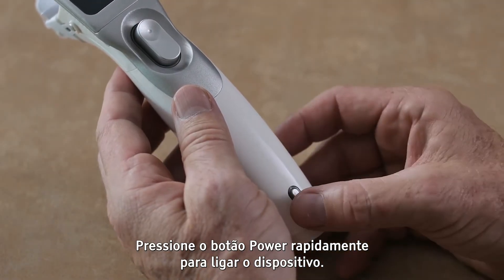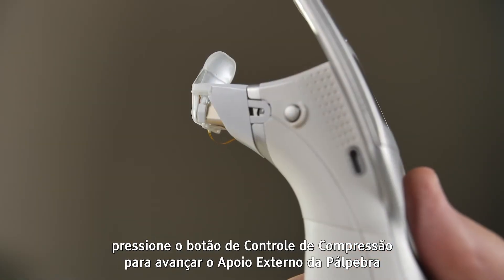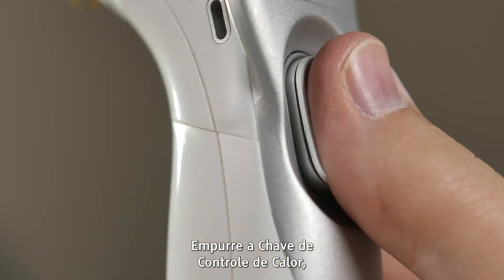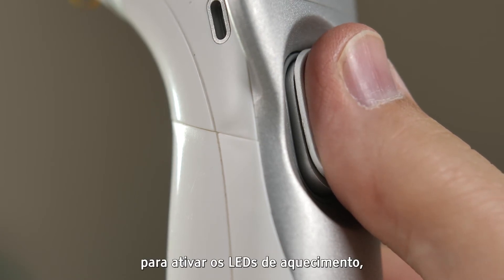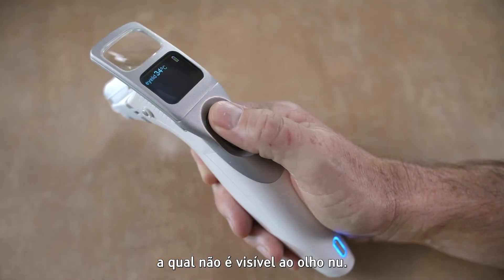Briefly pressing and releasing the power button activates the device. Once the smart tip patient interface is attached to the instrument, pushing the compression control button advances the outer eyelid pad toward the inner pad to apply compression to the eyelid margin. Pushing forward the heater control switch, located on the top of the compression control button, activates the warming LEDs, which emit a visible lime green light, as well as a near-infrared light, which is not visible to the naked eye.